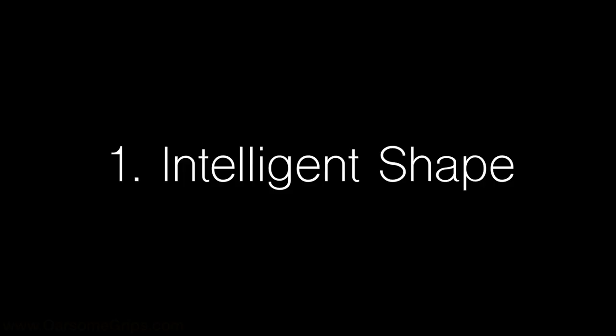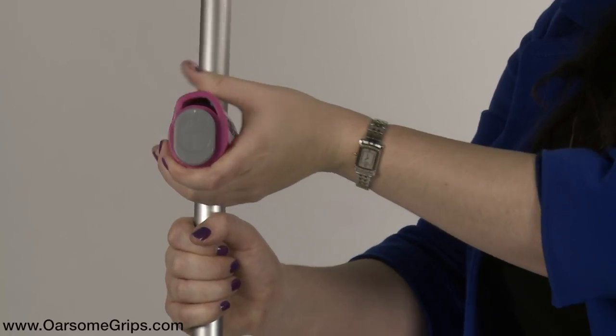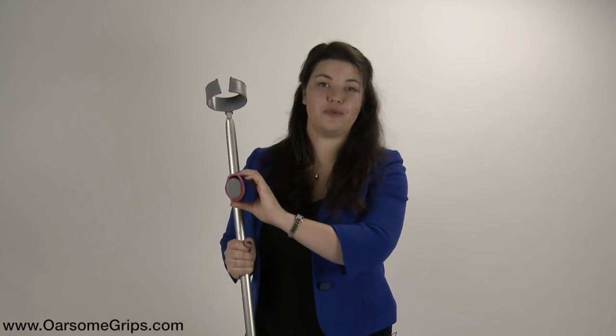Here's what you need to know about the Oarsome Grips. The shape is the key feature. This honeycomb section acts as a shock absorber, so every time you take a step forward, this bit compresses down and takes the strain off your hands, wrists, elbows and upper body.